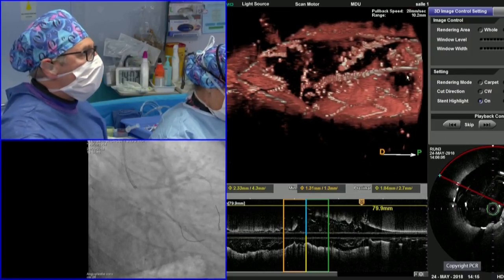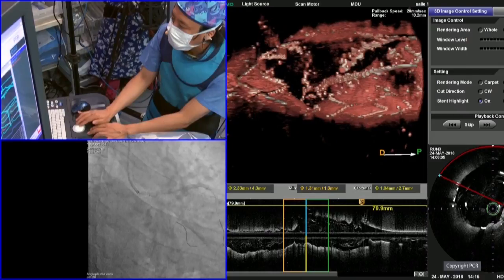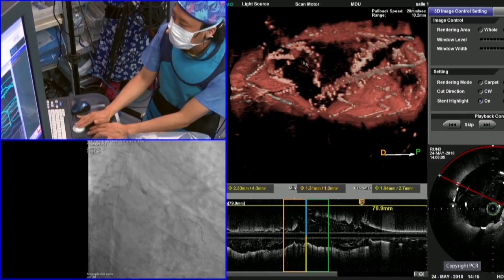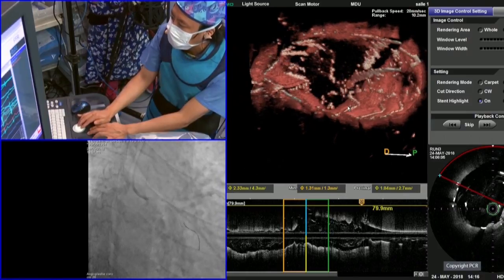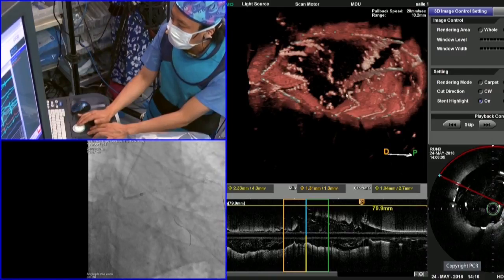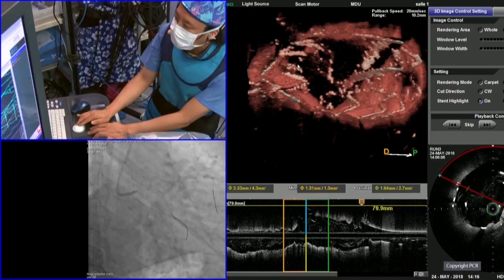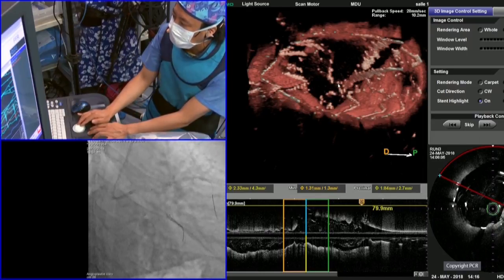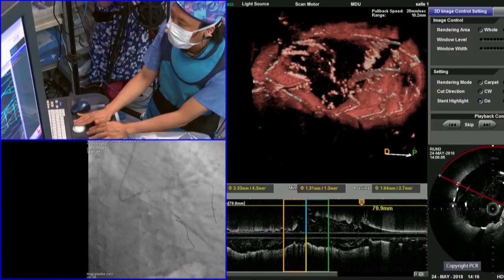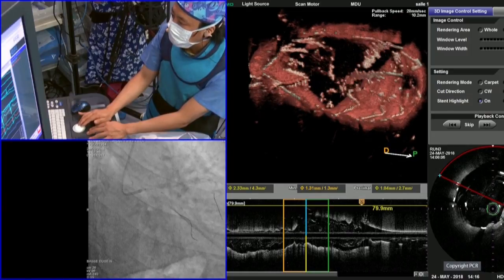So you can really see that the wire is taking this cell, which is not the distal cell. We should take this one, which is really the most distal cell in this case. You can also go this one, but there's a link in front of the side branch. It's not optimal, so the optimal one is in general the most distal one. And in this case, after POT, it's already a little bit expanded, so it's easy to take this most distal cell, the optimal cell. Okay, perfect.